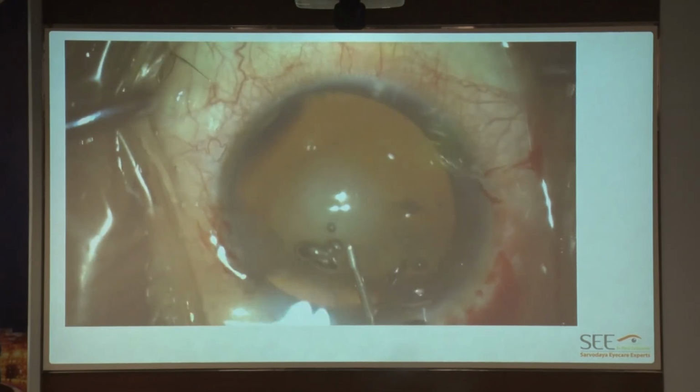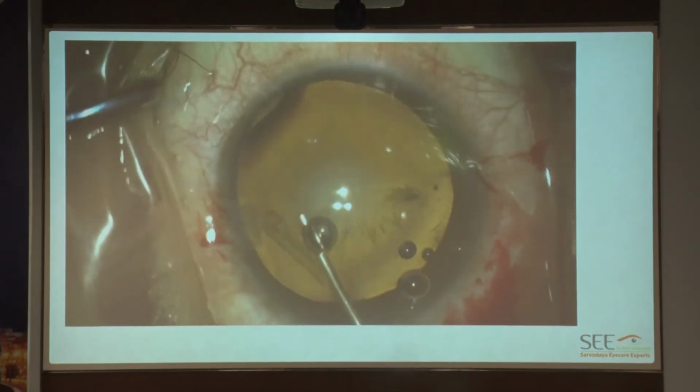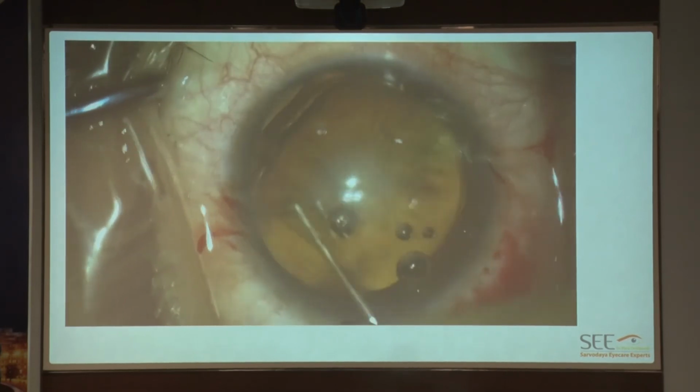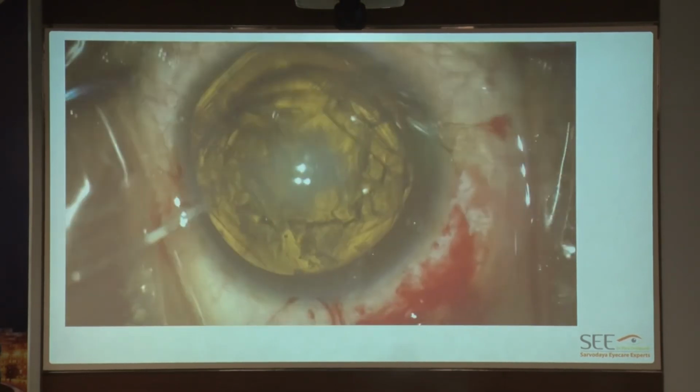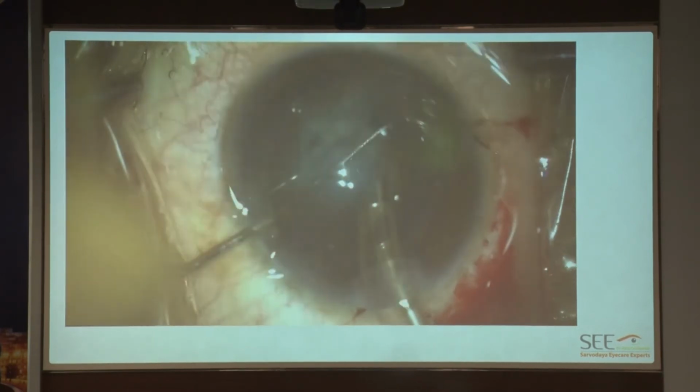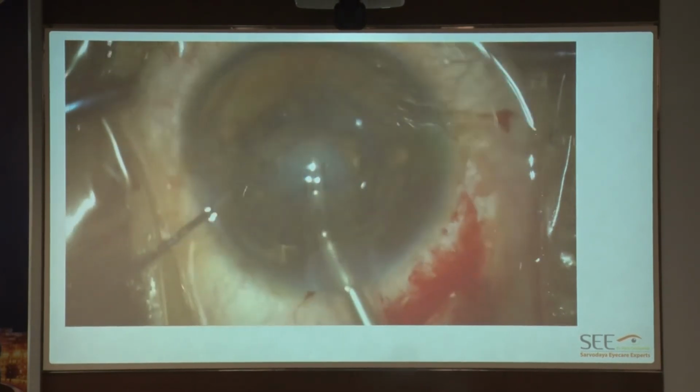So you do a routine hydrodissection. I think it's very important to do a good hydrodissection and hydrodelineation in these patients, and perform your routine phacoemulsification. Prefer a chop technique rather than a divide and conquer technique.